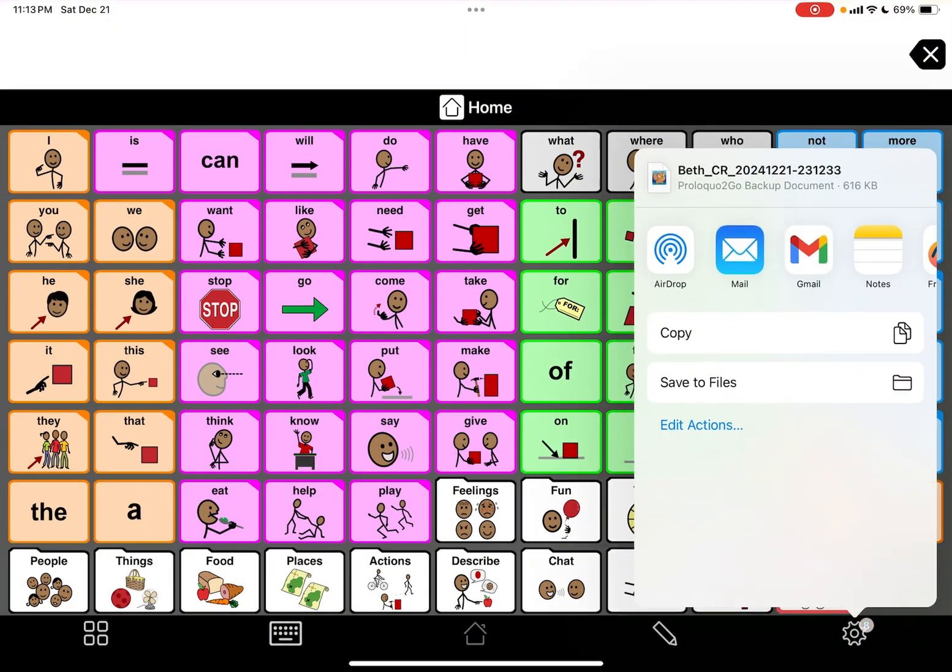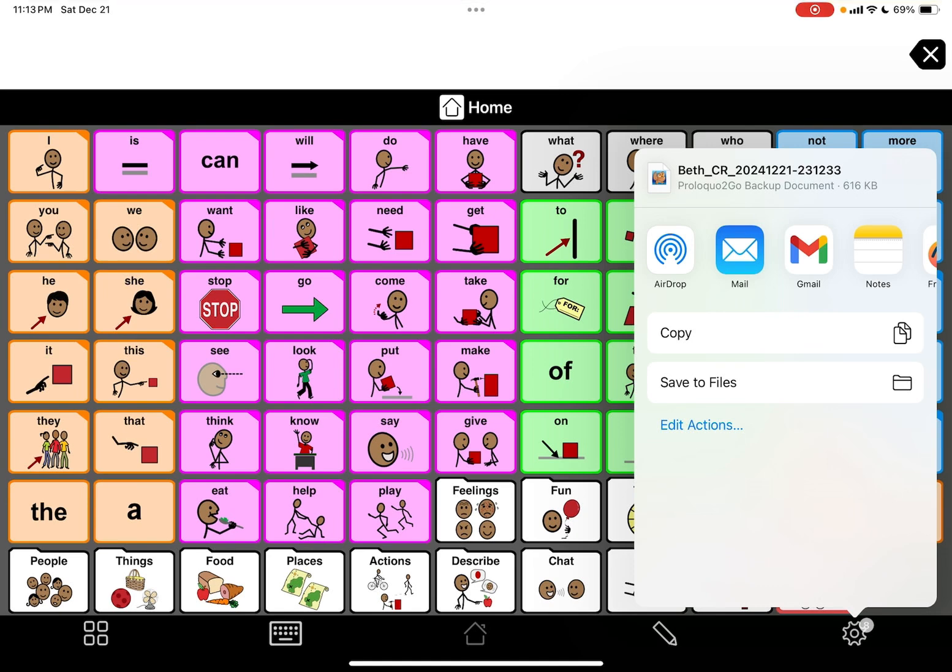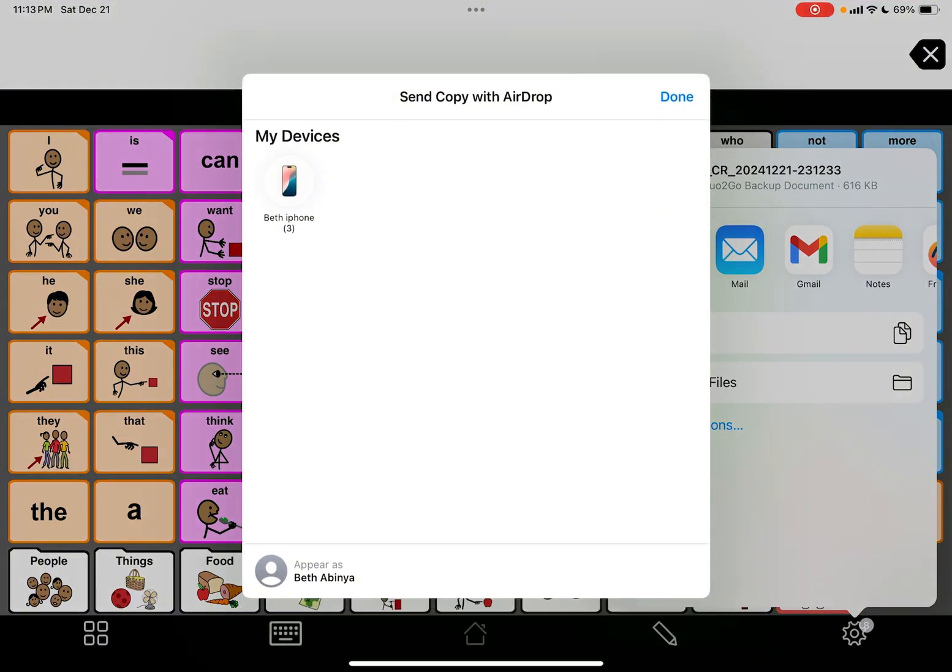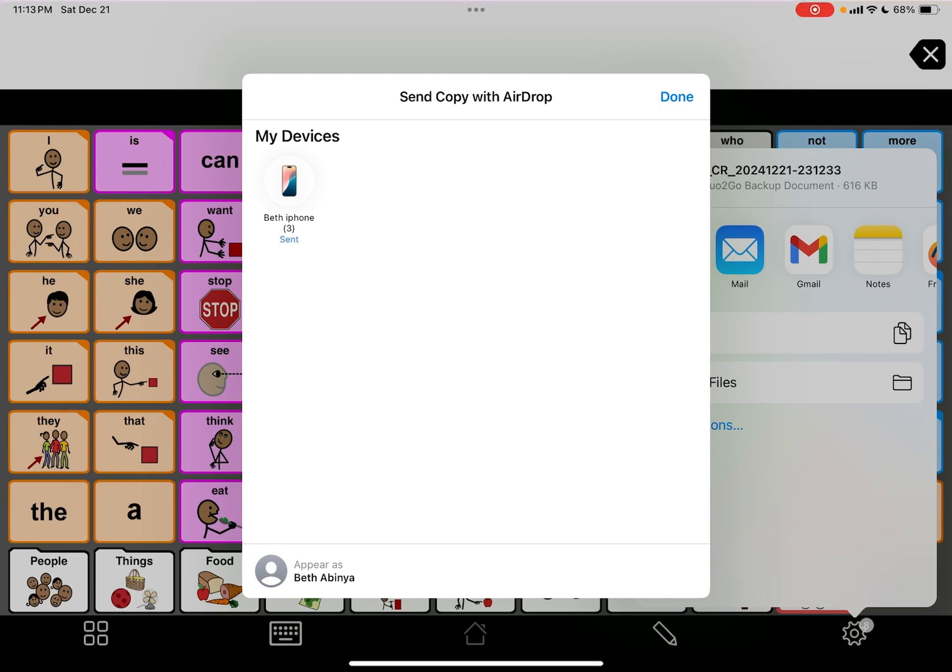You can AirDrop it to my phone because I have the Proloquo2Go app on my phone. So I can AirDrop it to that phone and you'll see that there is Beth iPhone. Okay, so I just got it. I know you can't see. I want to show you now how to email it.